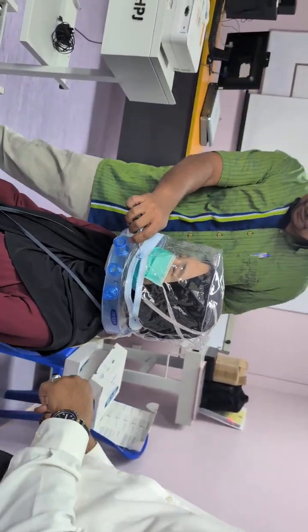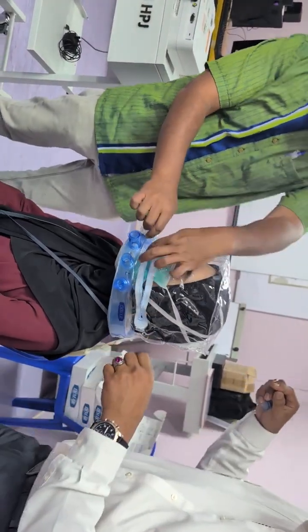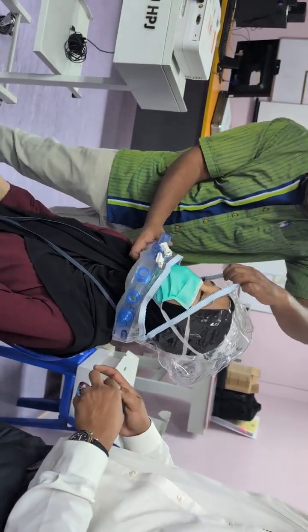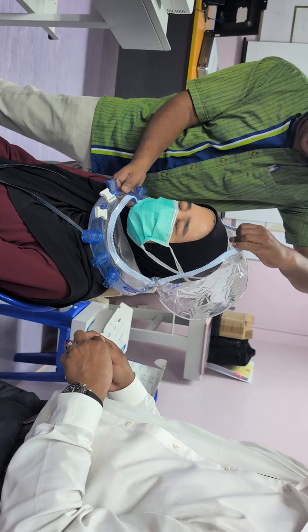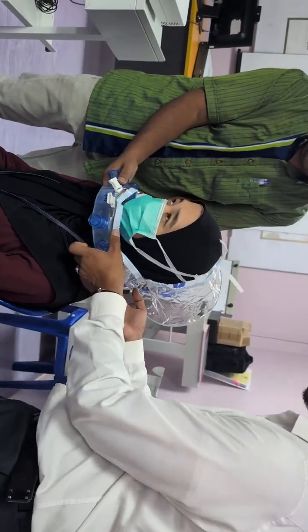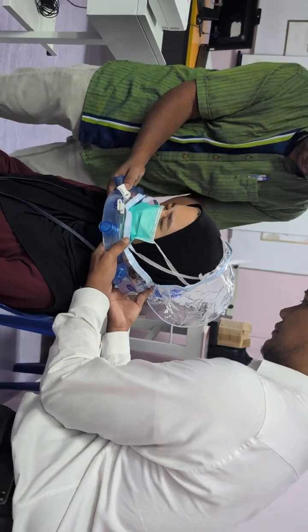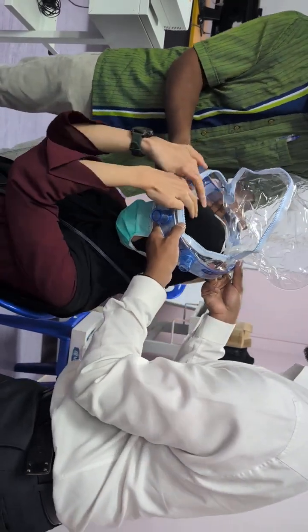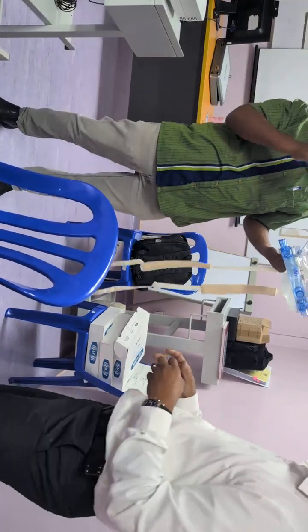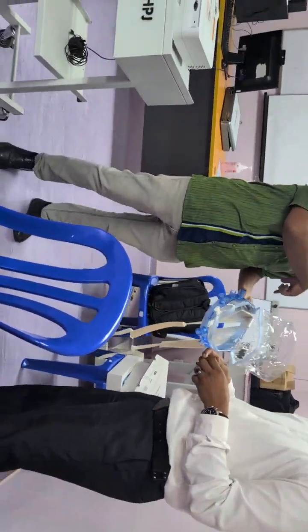Sini. No. Once it's inflated, you'll be fine. Oh dia, itu. Hold on. You hold on. You relax. Sorry. Okay, come. Tarik keluar. Front. Patient yang pakai tudung always to the front. Patient yang pakai tudung always to the front, not to the back.